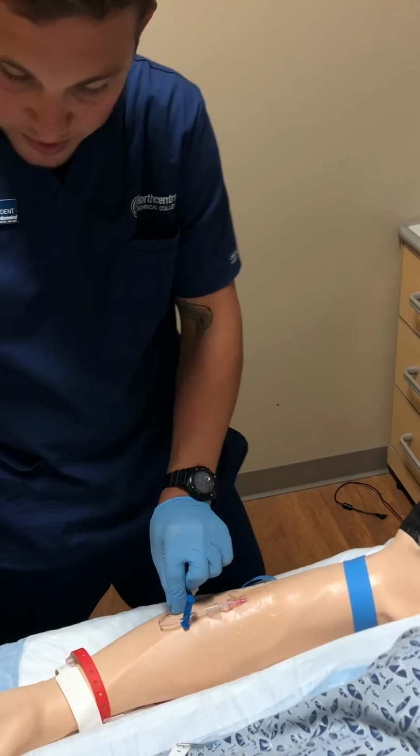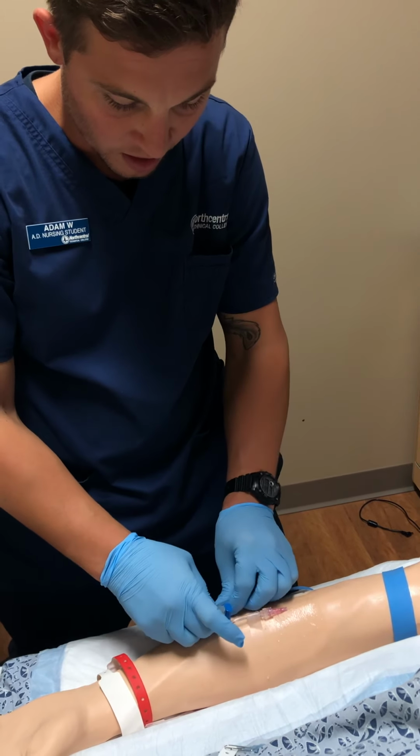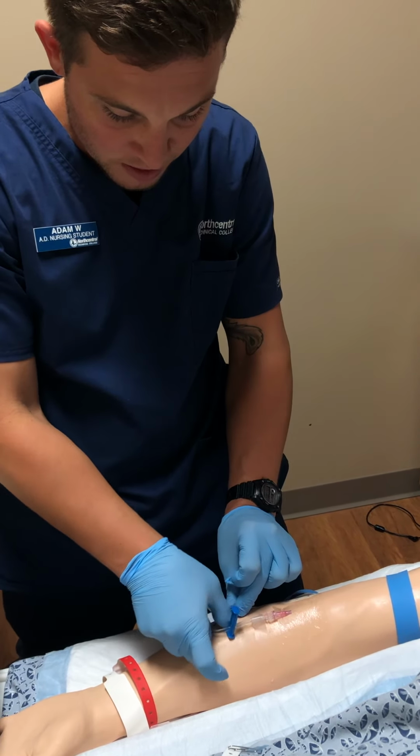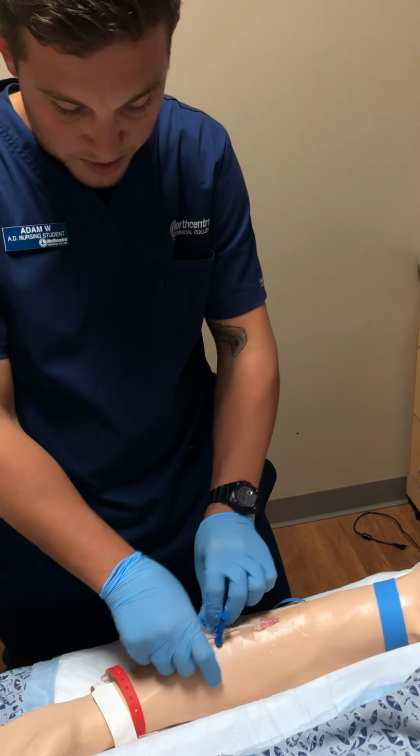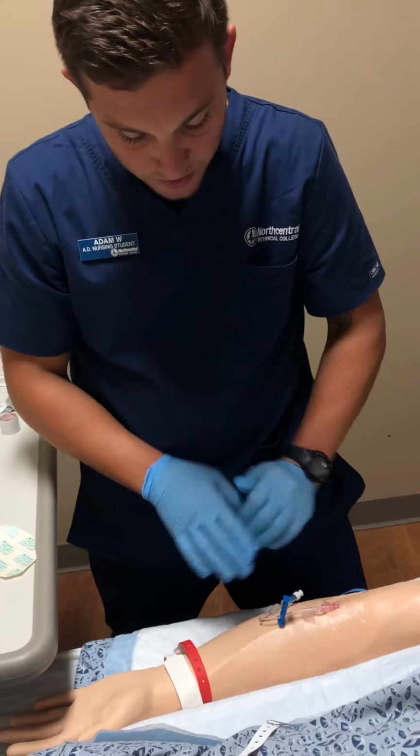I'm gonna put another little piece of tape up on it here, to get it out of the way from dangling. We don't want it to get caught on anything and have it rip out, causing extra problems for our patient. We don't want to be the cause of that, right? Okay, so we got everything secured here.